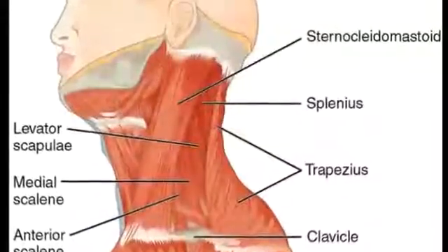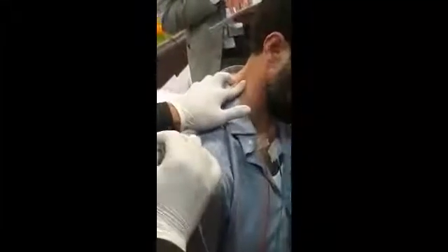Now I'm palpating for the trapezius muscle on this side, and then deeper to trapezius I'm trying to palpate for levator scapulae. Levator scapulae goes from the apex of the scapula to the lateral transverse processes of C2, C3, and C4, and runs under the trapezius. So in most locations you'll have to go through trapezius to reach it.